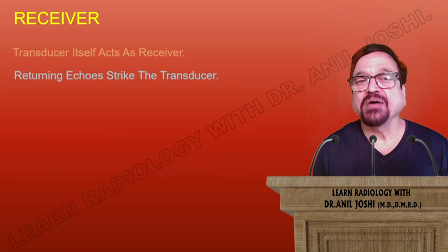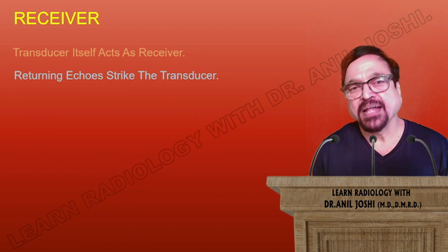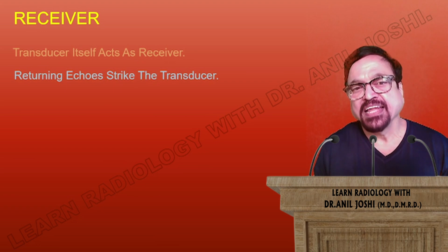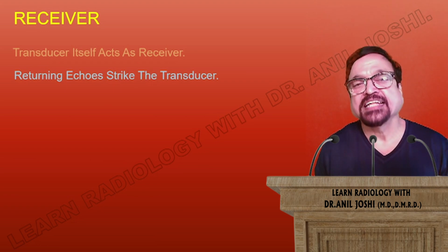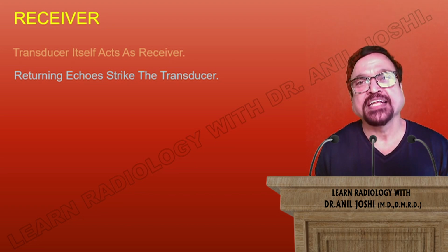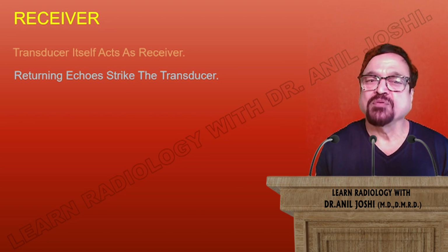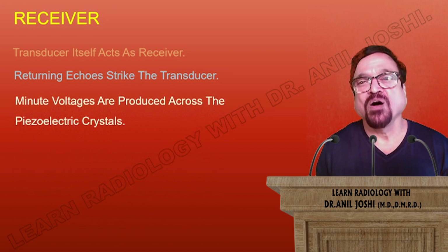Now here are the receiver and the sender. The image is acquired by receiving the echoes or sound waves coming back to the transducer, and that is the receiver. The receiver has the same basic piezoelectric principle, converting sound energy into electric energy, and then all these signals are fed to the monitor.